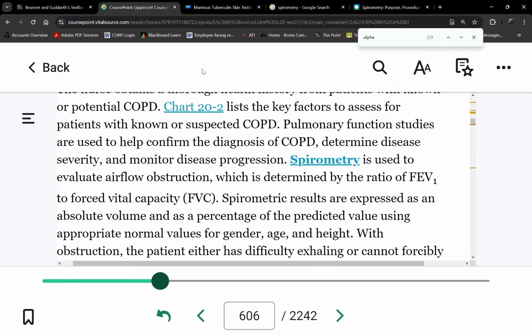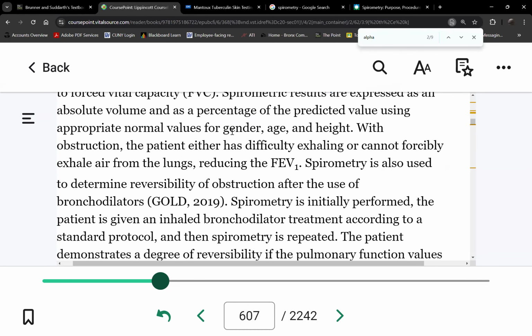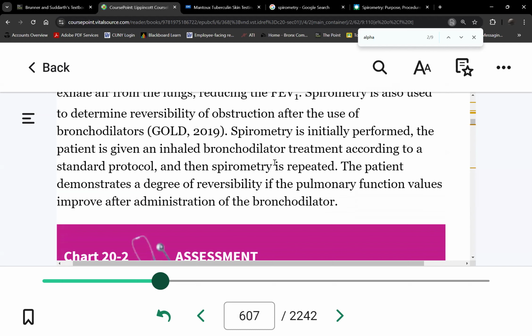So what are we recording? What are we measuring? Okay, the following. One of the tests being done is FEV1, which is forced expiratory volume in 1 second. Meaning the device will measure how many liters of air you can forcefully blow in 1 second. So if this number goes down and down, then they will be able to stage your COPD. How bad is your COPD? Because technically this is measuring the strength of your lungs. Okay? How strong or how weak is your lung?